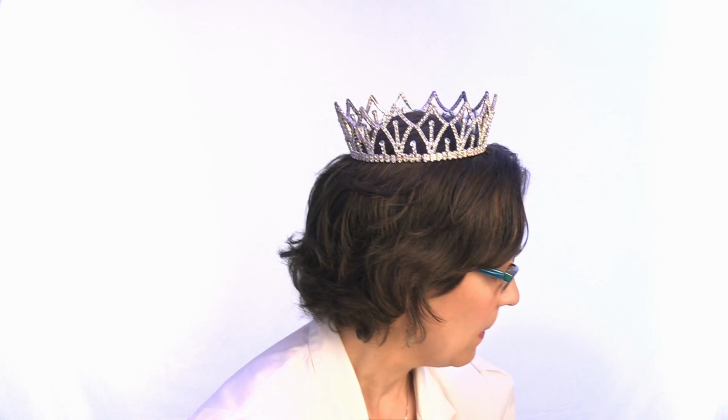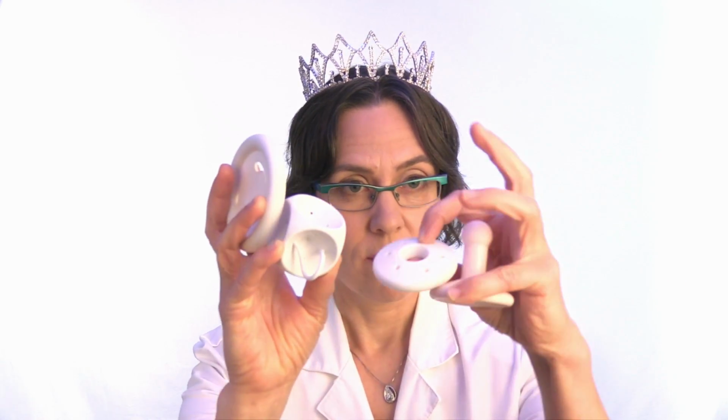There's a big incentive for you, though, to make the pessary succeed. So if you can find somebody who's willing to work with you, sometimes you need to try a whole bunch of different sizes and styles. You've seen the range, right? See, like here, we have some style differences. And let's look at a size difference. That one's smaller. So here are some of the size differences. You really need the right pessary, and sometimes women have to try a whole bunch of different ones. So one thing is having a care provider who will really work with you to help you succeed.